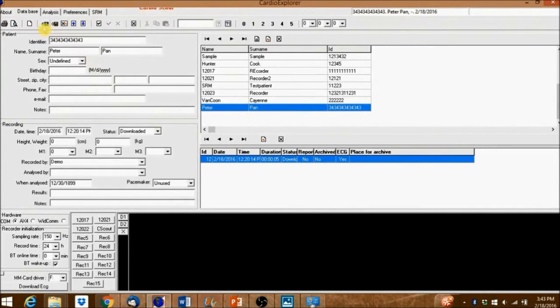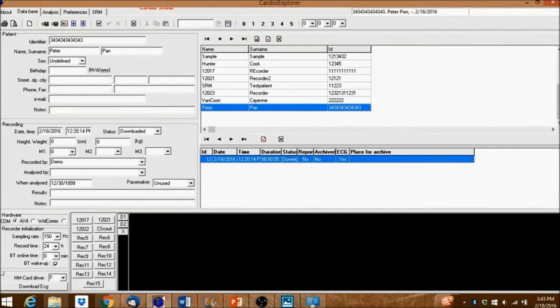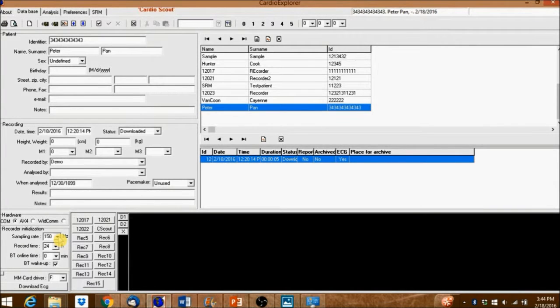You'll also notice that this icon appeared after plugging the USB cable into the computer. Change the recording parameters here. If you're using VetScout, set the sampling rate to 150 Hz.